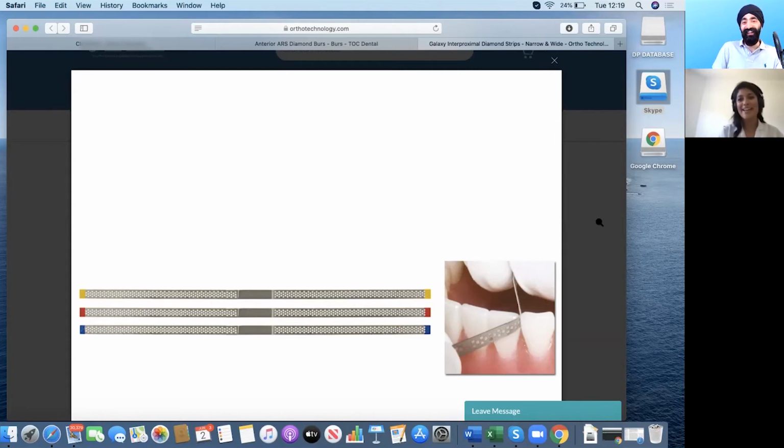That's when I think you want to then go in with your disc or your file as an adjunct. You don't have to just use one. You can mix and match. Yeah, exactly. This is a good entry, and then you can follow on with those other ways.